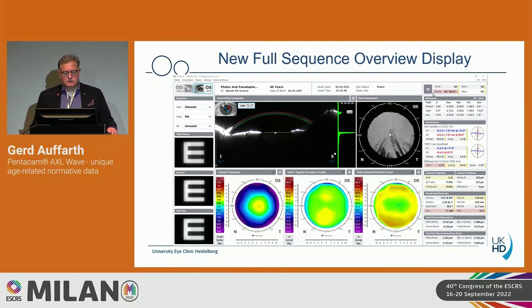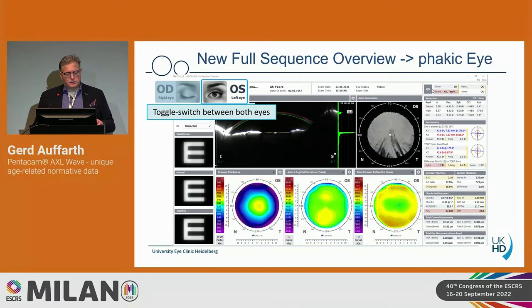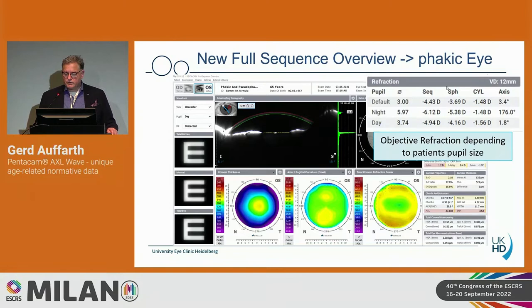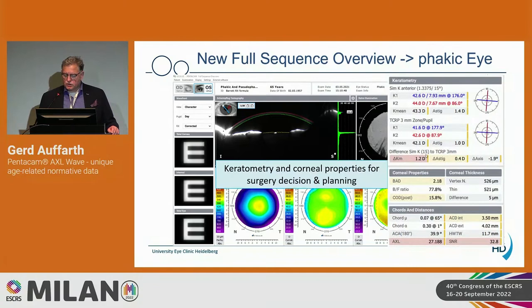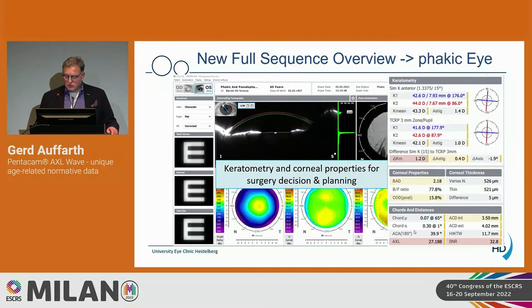The new full-sequence overview display for a phakic eye has a toggle switch between both eyes, OD and OS. You have the refraction displayed — quite interesting depending on pupil size, so night and day you see different pupil sizes and what impact that has on refraction. Then you have keratometry with all parameters, which can also identify previous laser vision correction. The optical axes, chamber depths, and axial lengths are all displayed.